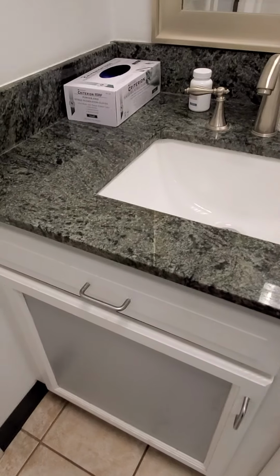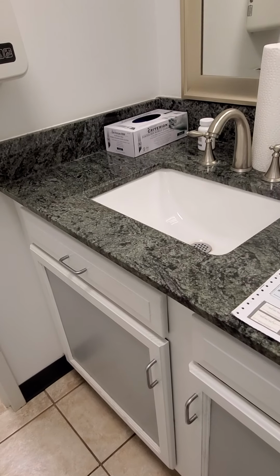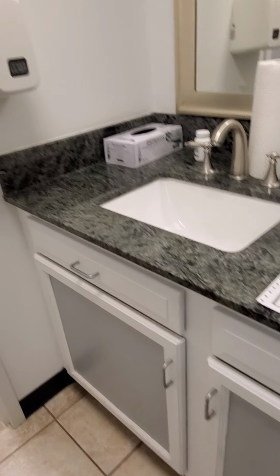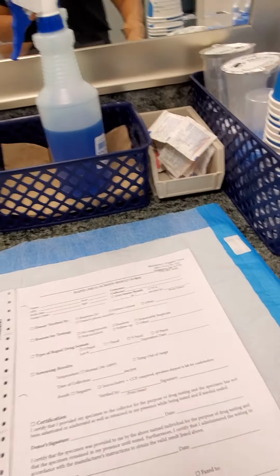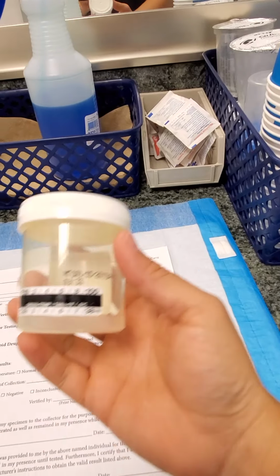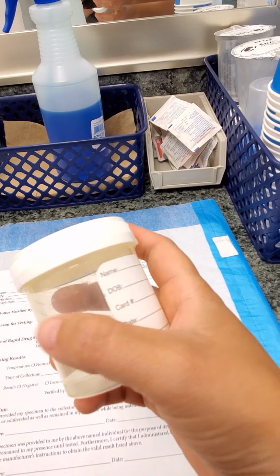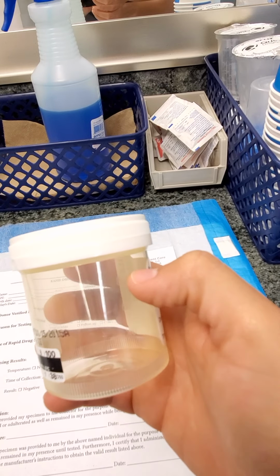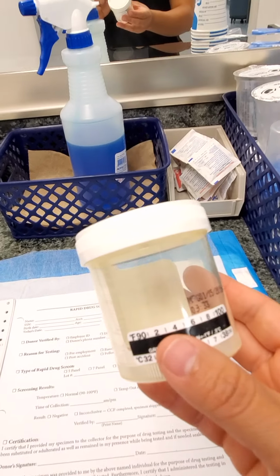Once the patient finishes washing their hands, you are going to instruct them that they're going to go in the restroom and give you some urine. Now, if you're doing an instant test, you can use these cups for rapid drug testing, and just tell them, maybe a little bit over half. That's how much you want. So let them know, I need up to here of urine.